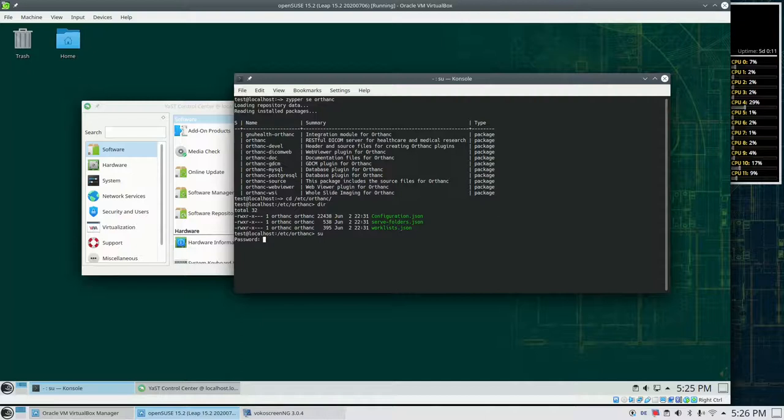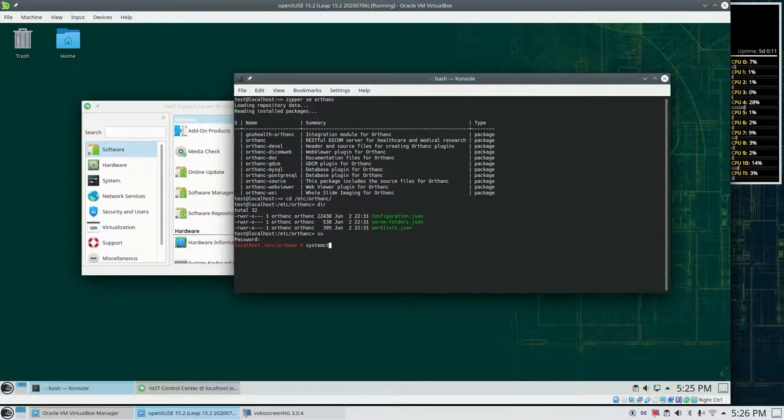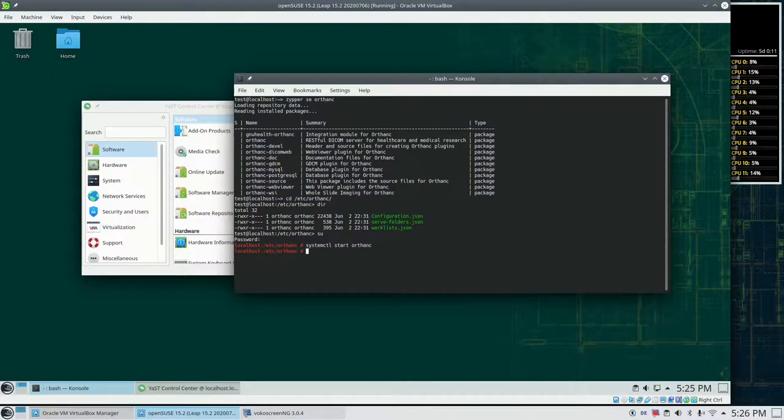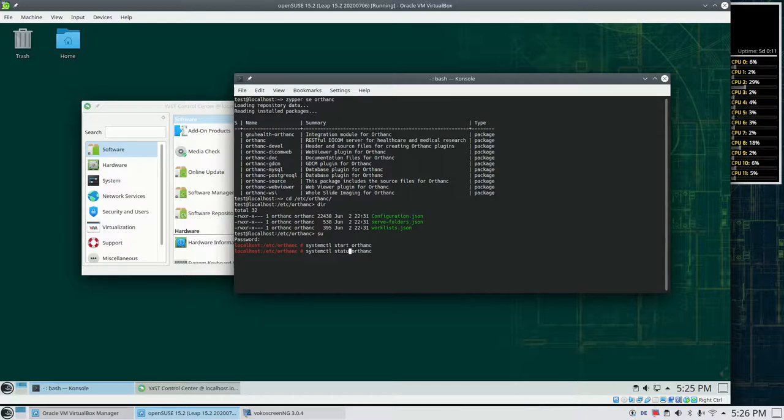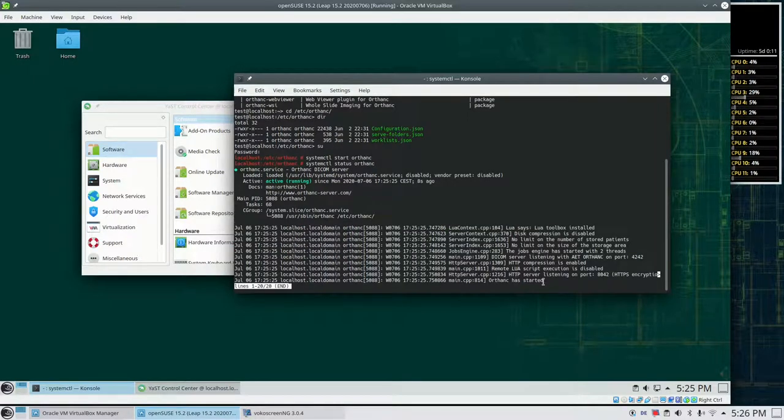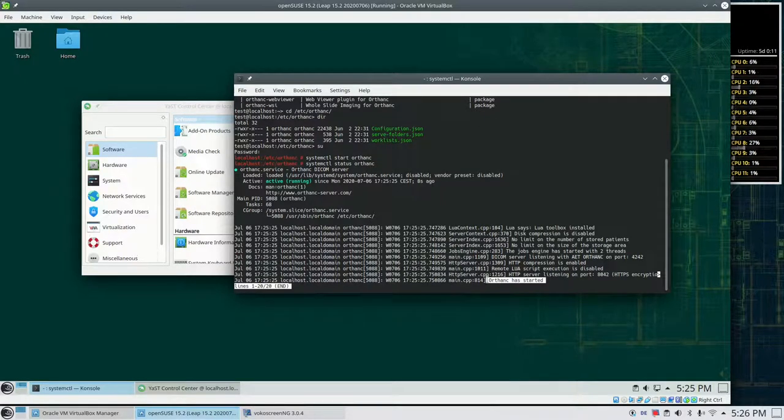So I log in as admin and start the server for Orthanc. systemctl start orthanc. Okay, done. Now let's check what the status is. So result down here. It says Orthanc has started. So great.